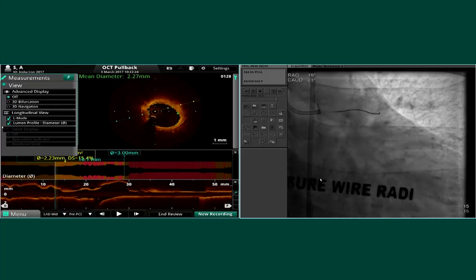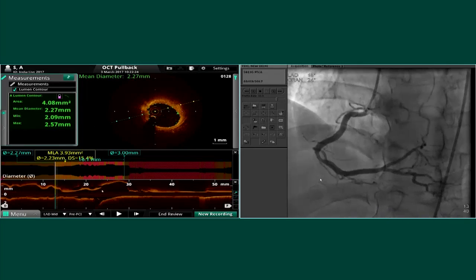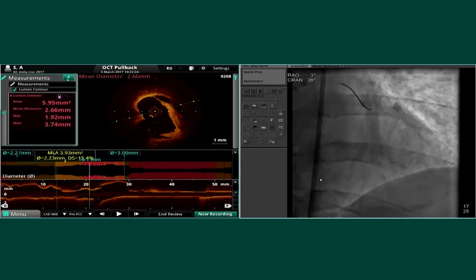While you continue to talk, I'll try and salvage the diagonal which occluded when we were actually doing the cutting balloon. Okay, so you continue to look at it. So here we are.